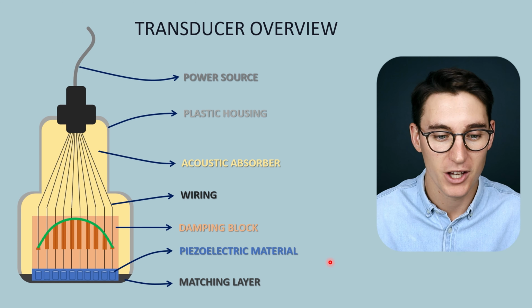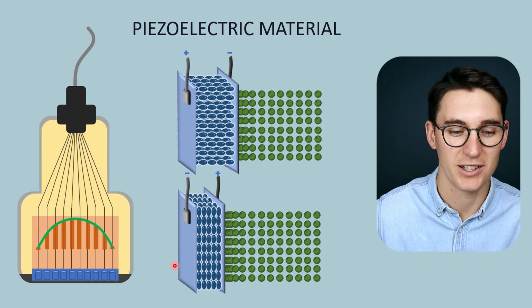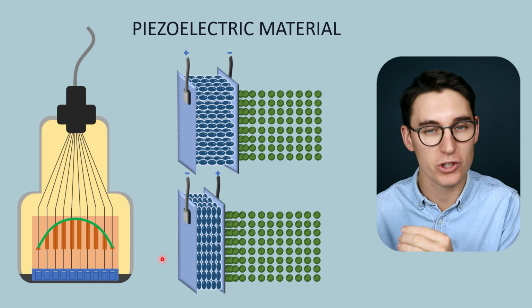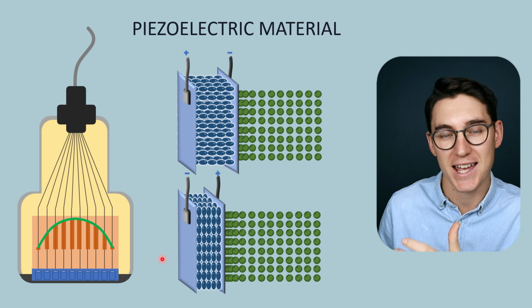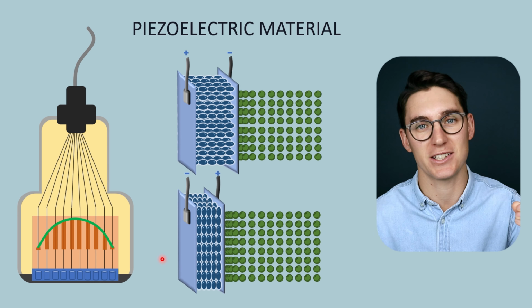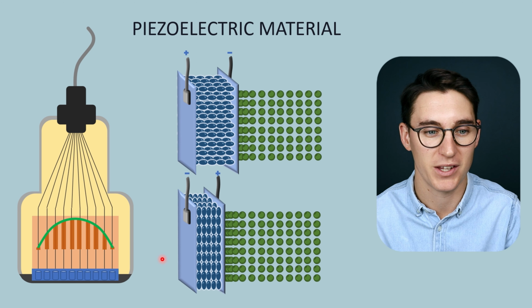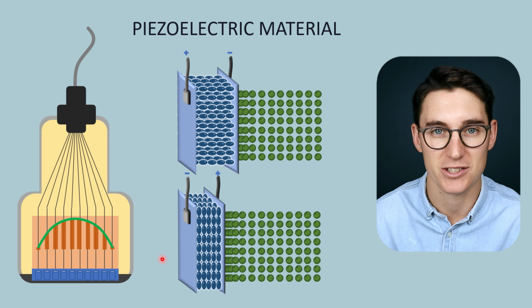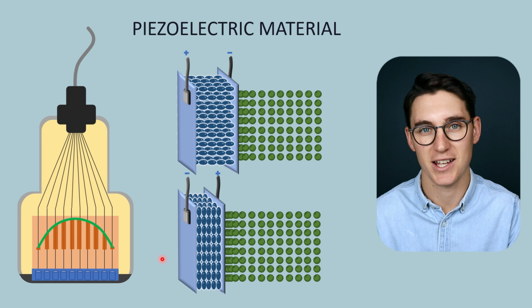So the piezoelectric material sits at the front of our transducer here, and it's responsible for creating the ultrasound waves, but it's also responsible for receiving those returning echoes or the returning scattered waves and converting that energy into an electrical signal that we can then convert into a digital image on our ultrasound machine. Now the piezoelectric material is made up of what is known as a PZT crystal. Now that PZT material has unique characteristics.